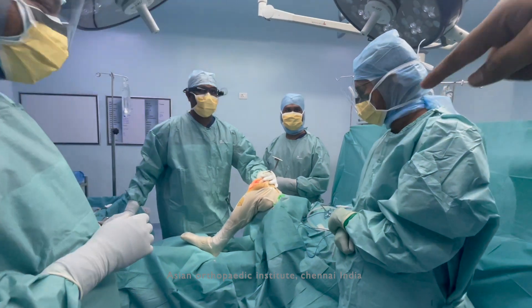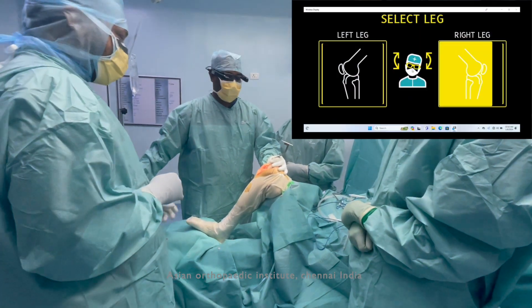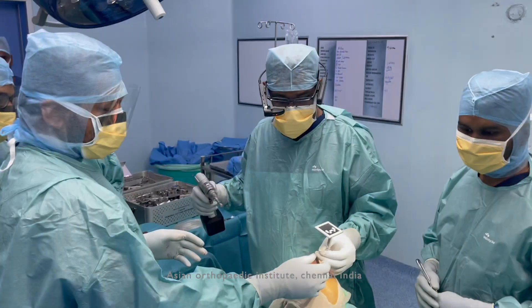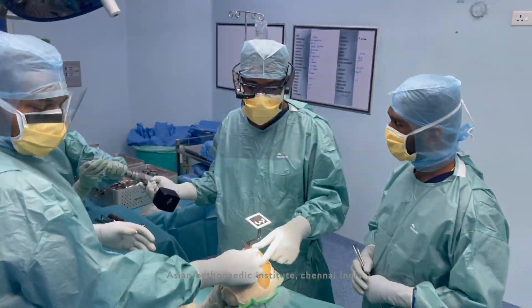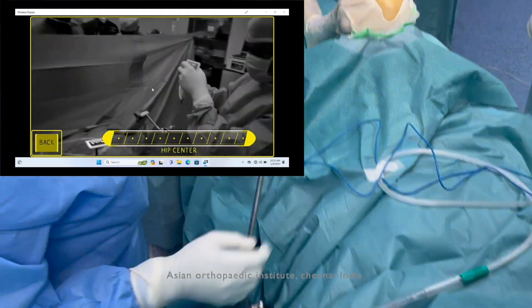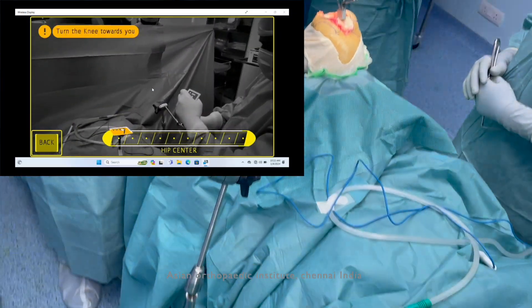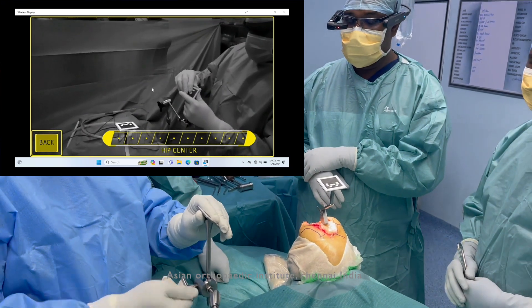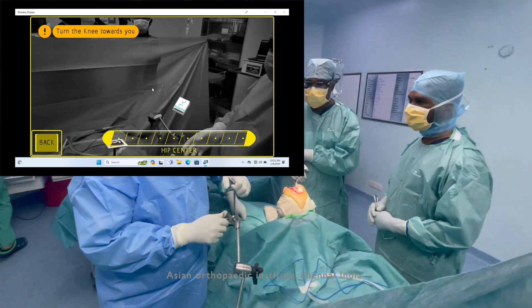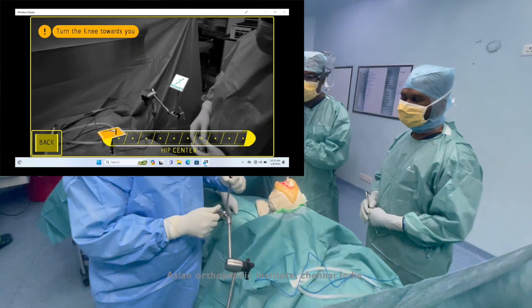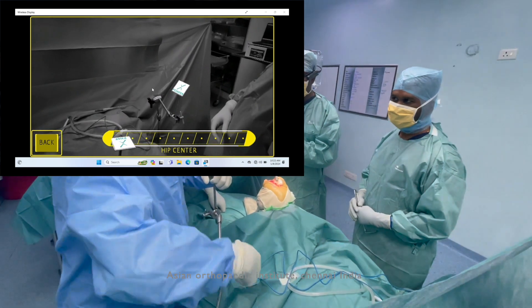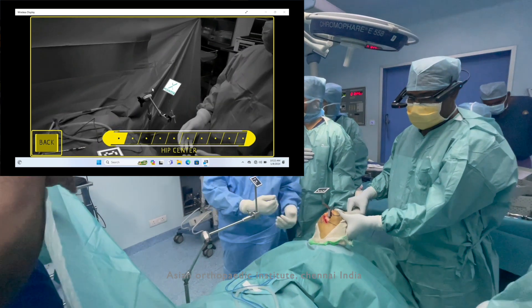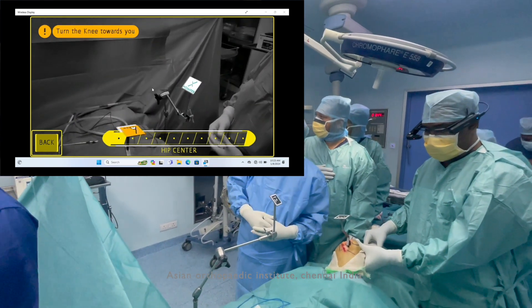Once the knee is exposed, fix the femoral tracker at the entry point and stabilize the tracker with pins. You can see the QR code and the reflectors. Use a pelvic side support with a tracker on it to serve as the reference — now we have a tracker on the pelvis.